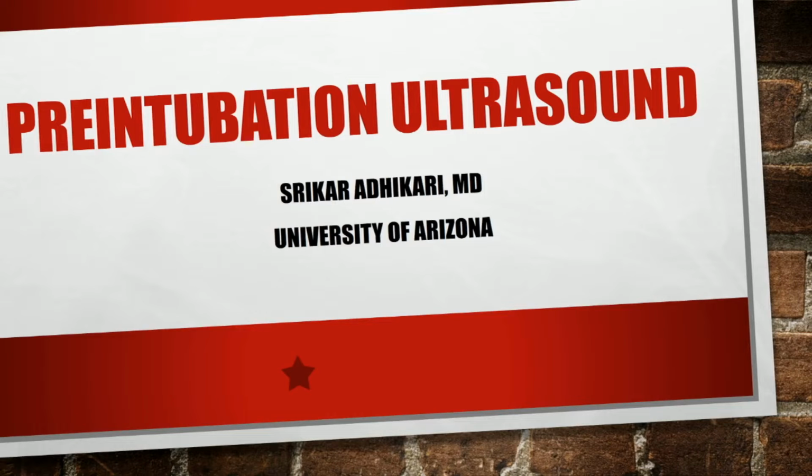Going to talk about is essentially what you do normally in cardiac ultrasound, right? So this is something with bread and butter. You have done this 100 times. But I just want you to, this is one of my favorites. So it's just a concept which didn't occur to me for practicing cardiac ultrasound for 10 years or whatever.